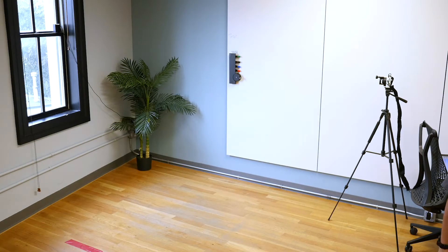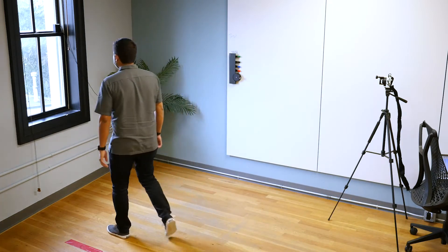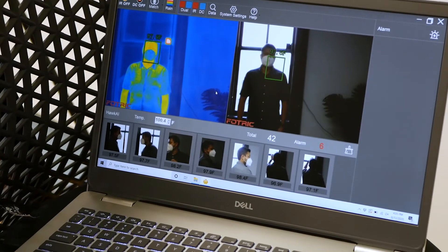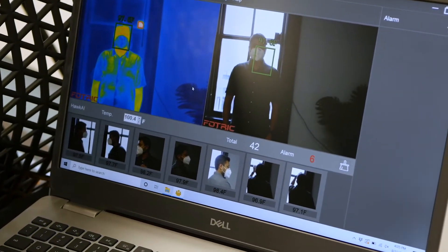The first thing to avoid is windows in the background of your screening area. In this example, we purposely set up the 226B incorrectly with a window in the center of our screening area. The window causes the scene temperature to be elevated. The camera will attempt to compensate, which in turn will skew your measurements.